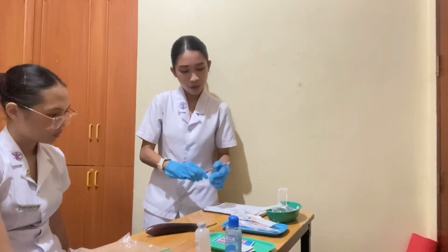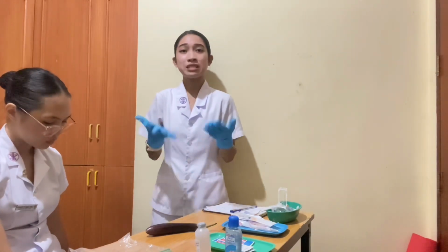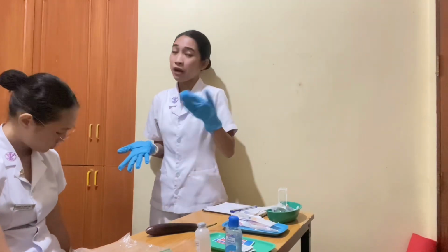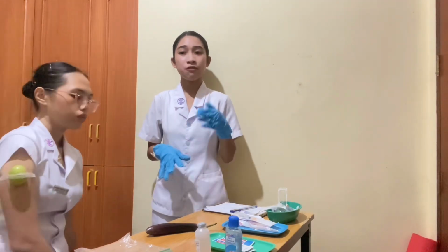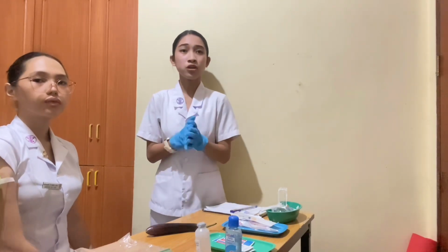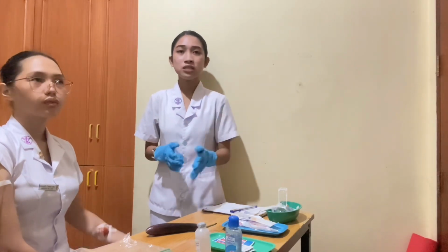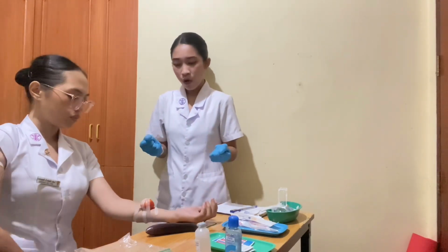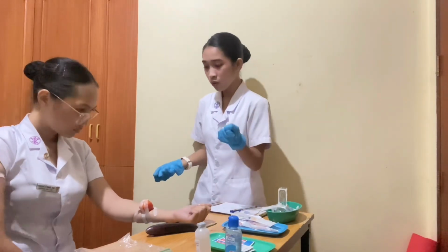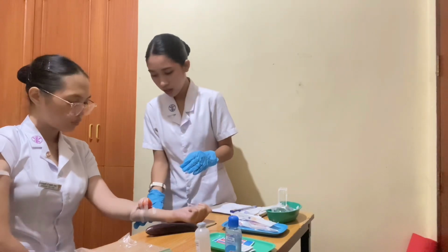Okay, so after 30 minutes we need to evaluate the site again, if there is any redness and induration, and document it. So let's assume that 30 minutes have passed, so we need to evaluate the site. Okay, ma'am, 30 minutes have passed. I'm going to check this site. Okay.